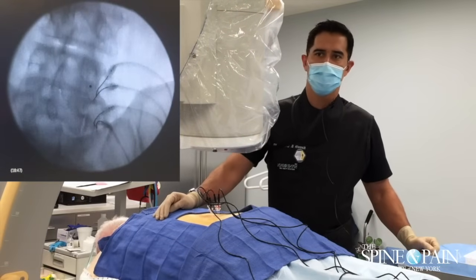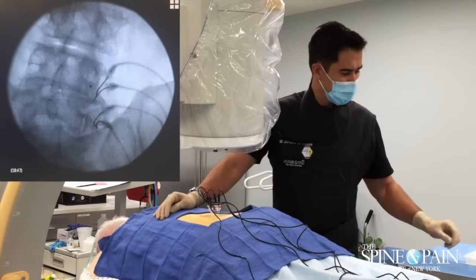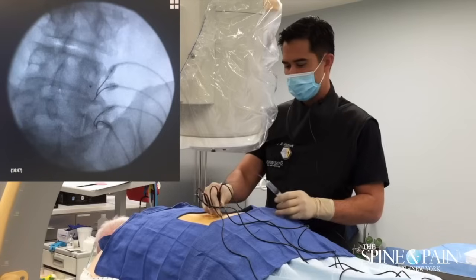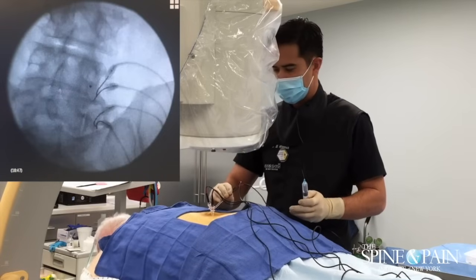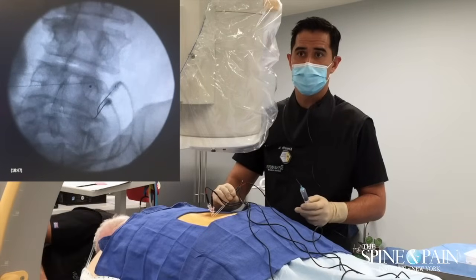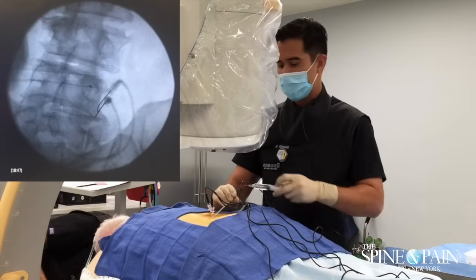Alright, get ready for the next level. We'll pull those out and move on. You okay out there? Doing great, buddy — just hang in there. You got a little pinch, okay? Doing great.